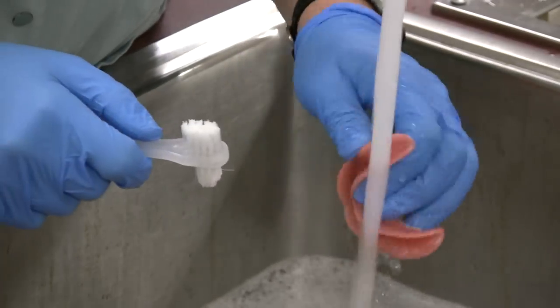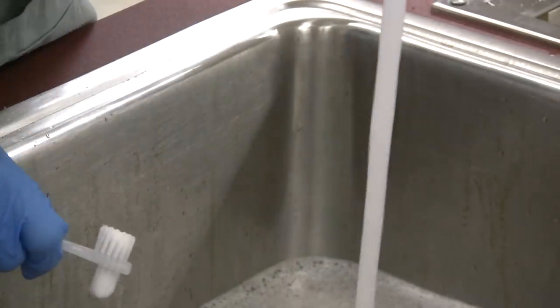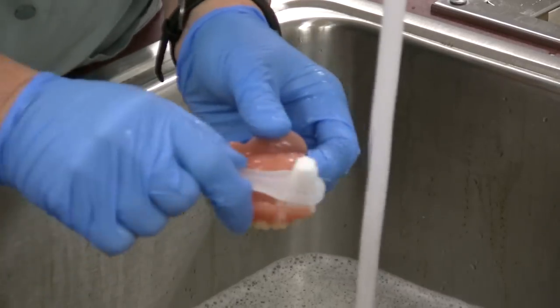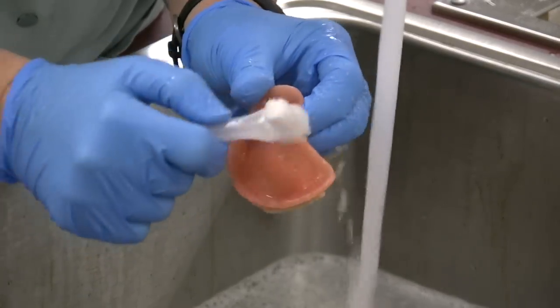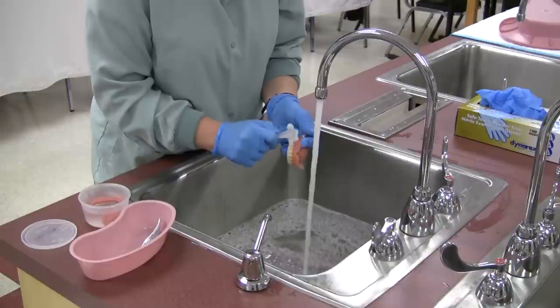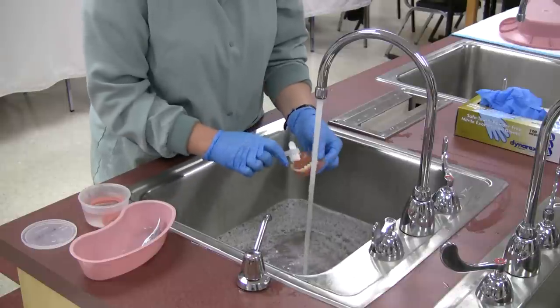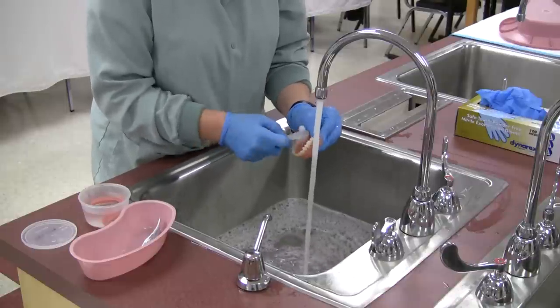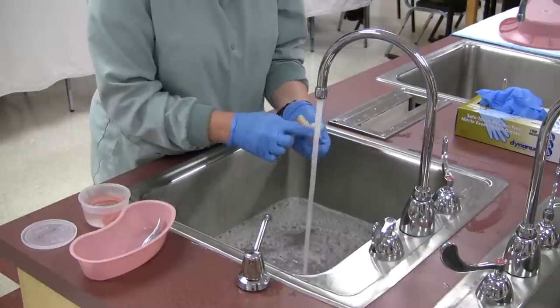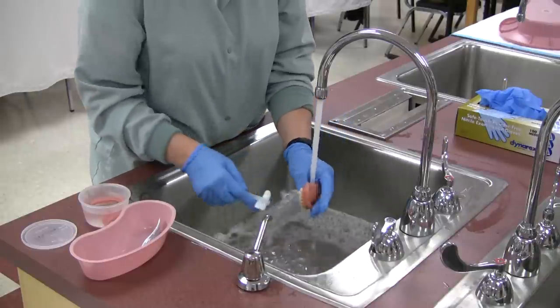Rinse the surfaces of the denture under tepid running water. Before placing the denture into the cup, rinse the denture cup and lid. Place the denture in a denture cup with tepid water and place the lid on the cup. Rinse the toothbrush and place it in a designated toothbrush basin or container.